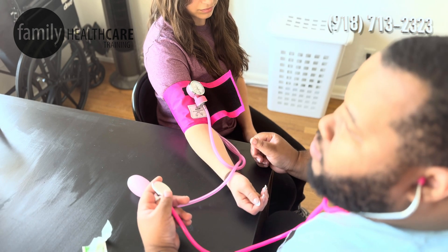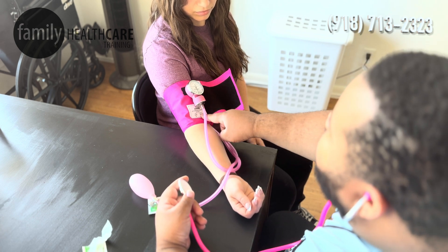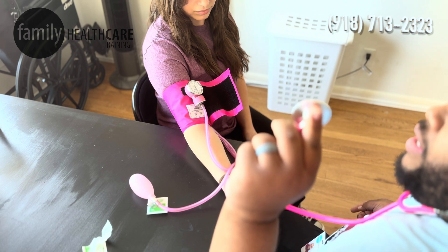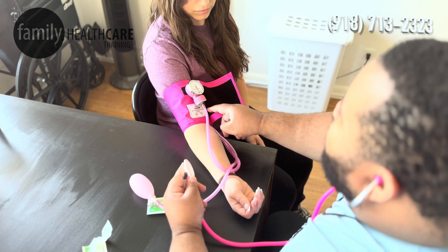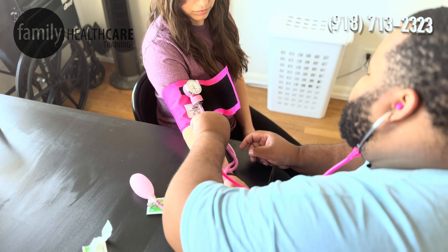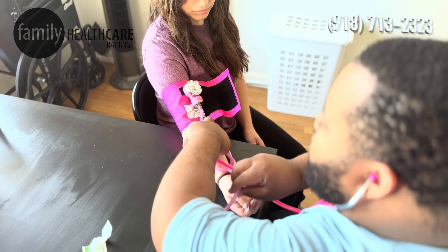When we are taking that blood pressure, the cuff actually tells us where to put the diaphragm of our stethoscope. Since we're on Miss Ashley's right arm, I'm going to follow it down just underneath where the cuff is.